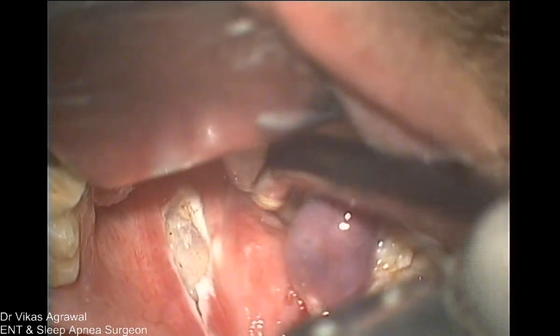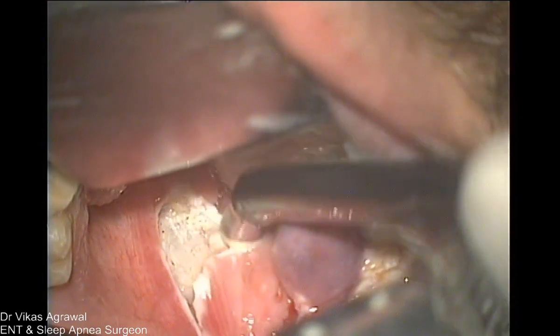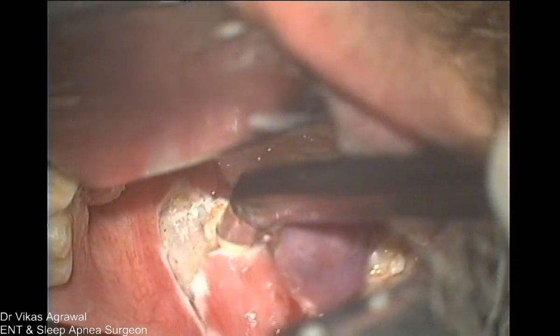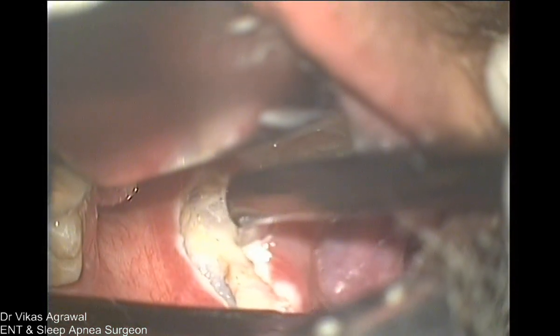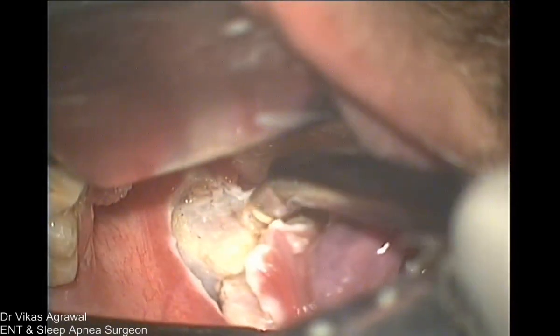So fine, this is the lower pole. Lower pole I'll go again intracapsular. So we'll not remove the whole tonsil at the lower pole. We'll do intracapsular dissection so that we do not expose the tonsillar artery.